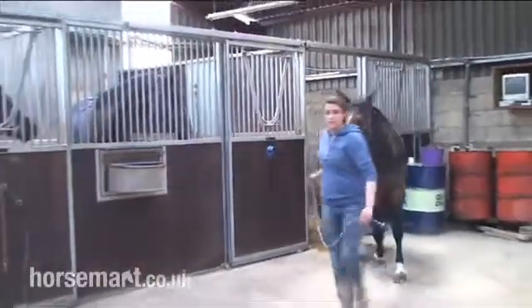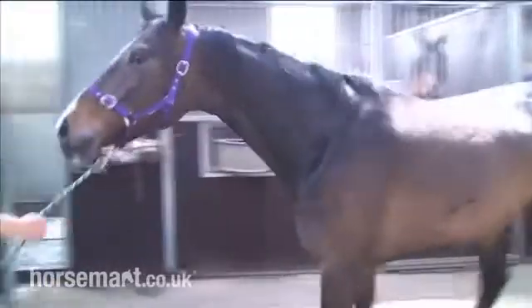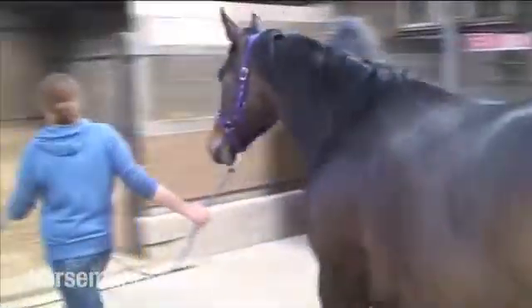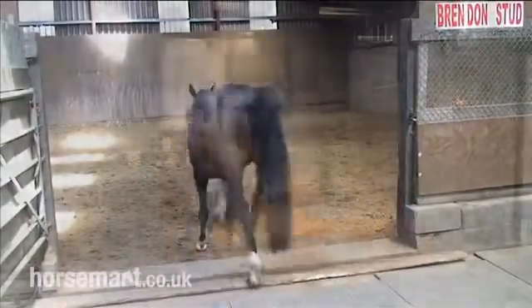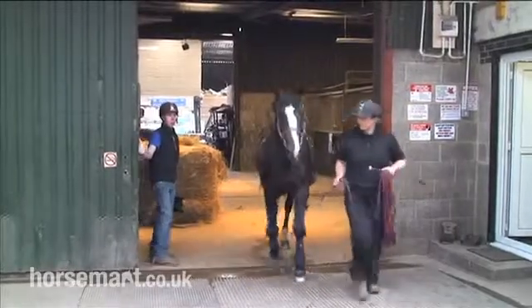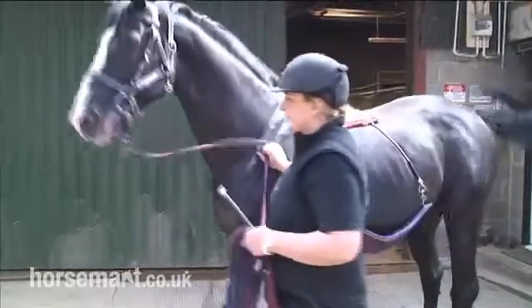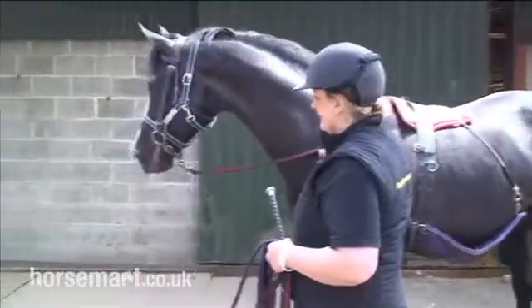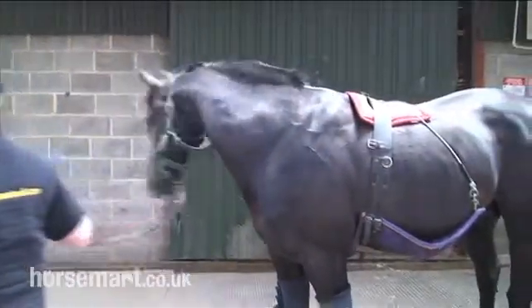This is our teaser mare. She's being led round to a small pen just in front of the phantom mare. She's used to arouse the stallion. This is the stallion, Unbelievable Darko. He's brought quietly into the collection area next to the phantom.